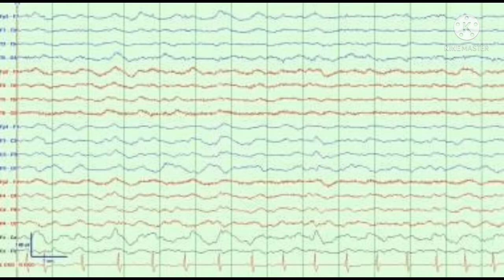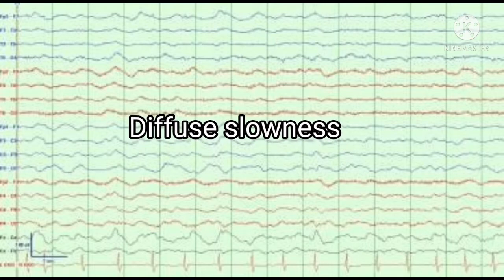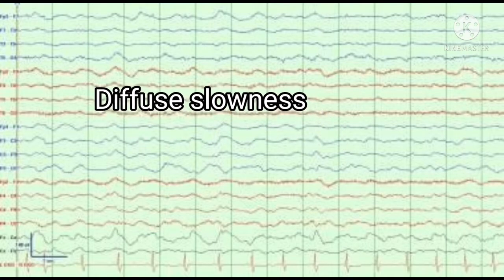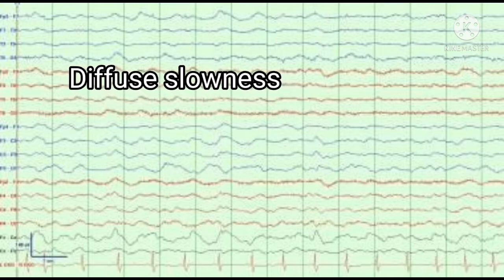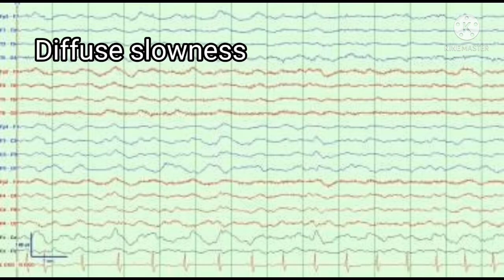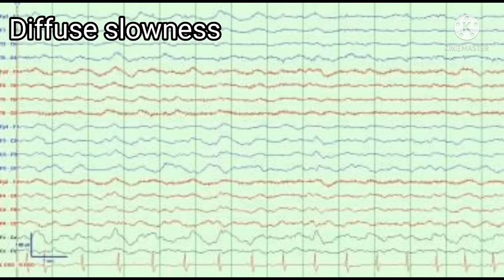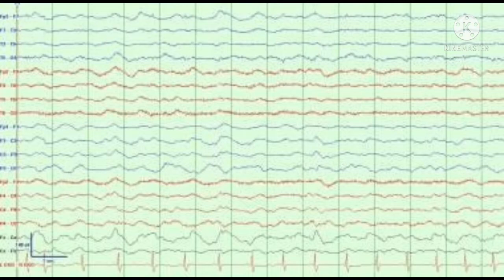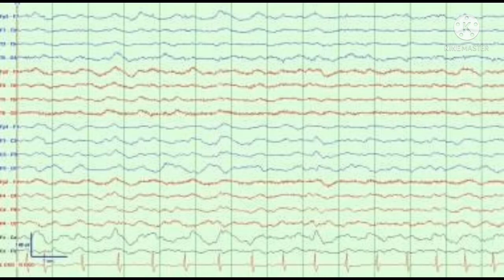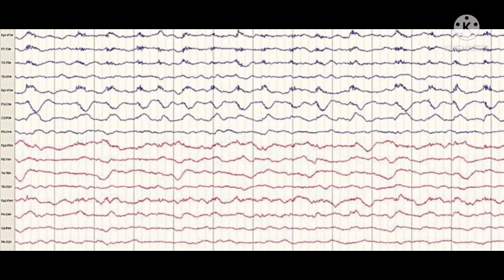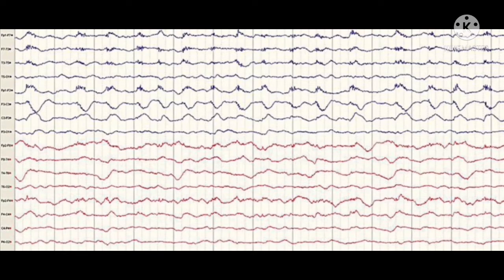Starting with the diffuse slowing, we have slowing of the posterior dominant rhythm. This means it is below 8.5 hertz in an adult awake. The posterior rhythm when it is 8 hertz or less is usually abnormal in an awake adult. The slow posterior rhythm is usually less stereotyped than the normal rhythm, less likely reactive to eye-opening, and usually associated with theta prominent more forward of the occipital region. The slow posterior rhythm is usually interpreted as being abnormal but non-specific. Possible causes include toxic metabolic encephalopathy, degenerative dementia, and multifocal vascular disease.